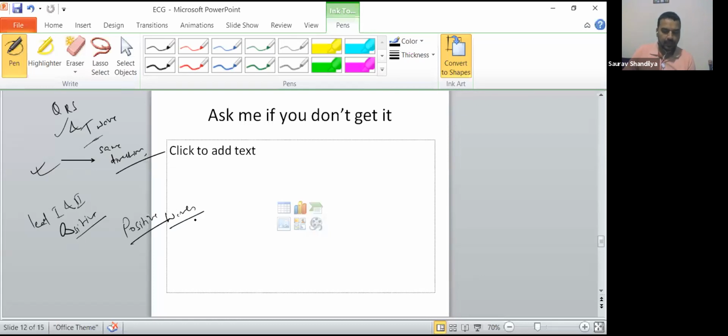Okay. Now, last important point. I have a video also. I think the video is there on YouTube also. If it is possible, I'll search for it and give it to you. aVR. Okay. These augmented lead graphs, when you see them, let me tell you, my dear friends, everything here should be downward. Everything should be downward. Keep this much in mind. Many things will be solved.